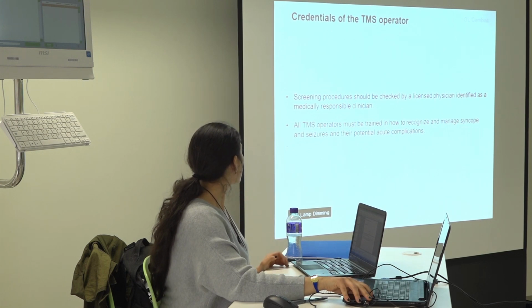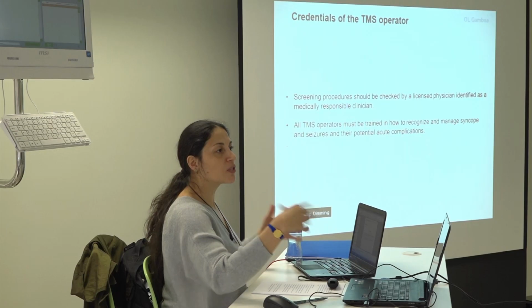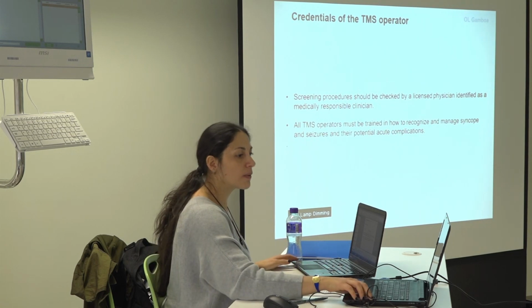Again, all TMS operators must be trained to recognize and manage syncopes. Mainly, just keep calm. And obviously, in principle, do whatever your physician told you to do, including for all the possible complications that come from seizures and syncope.